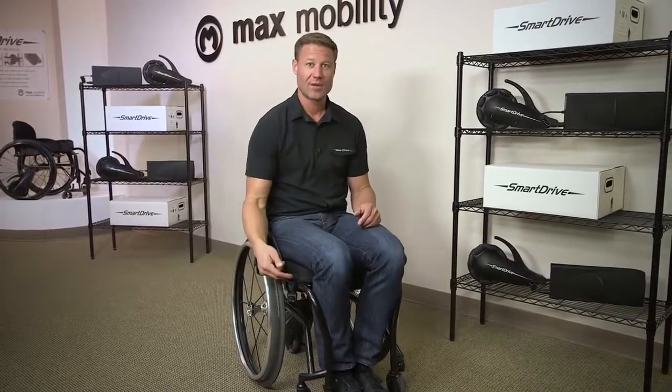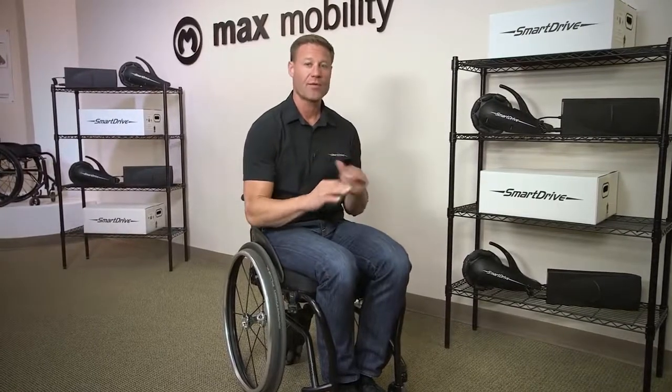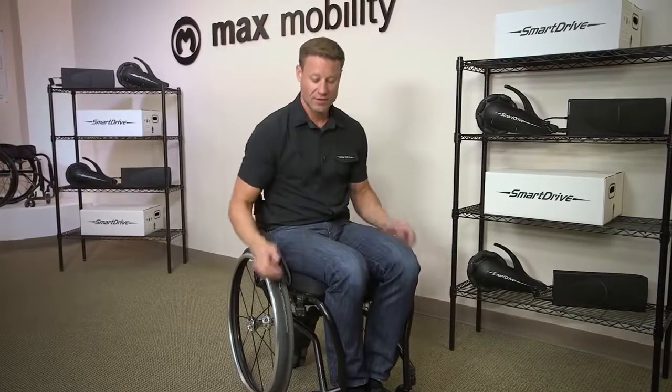Outdoor mode is just like indoor mode, except you must press a button to stop the motor. It will not stop no matter how hard you try. This latching on feature allows you to turn sharply, cruise up hills, and power down sidewalks without the motor stopping and having to push to get going again. So let's take a look.